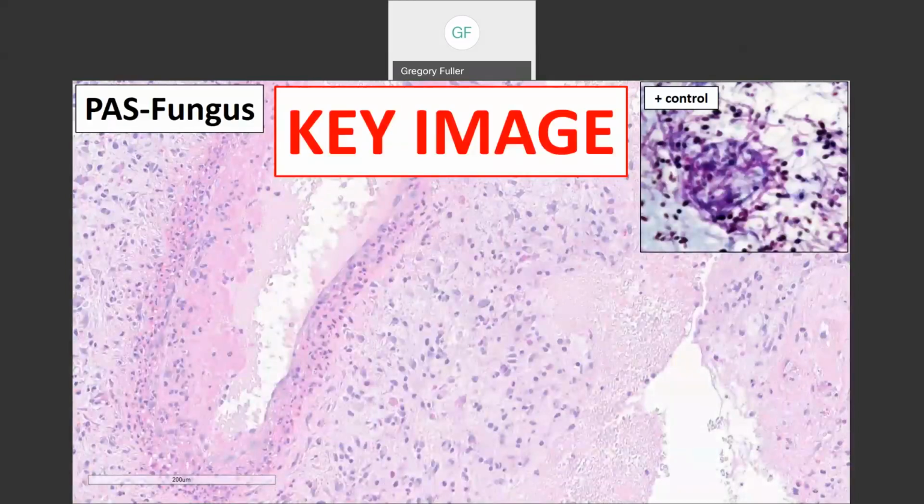Do you see the polys that I was mentioning? Look, you see here, look out here. These are not polys. This was the image. Okay, was that tricky? Was that unfair? Are you mad? Is it unfair?